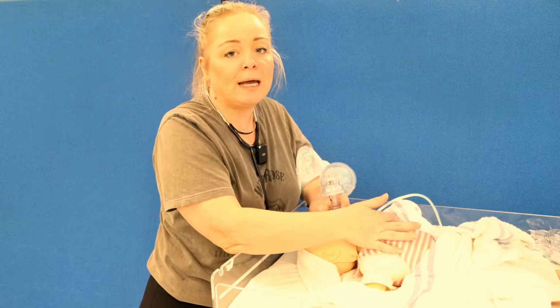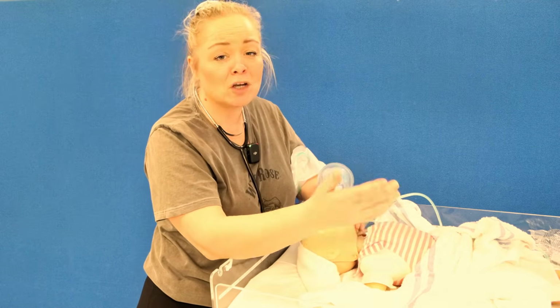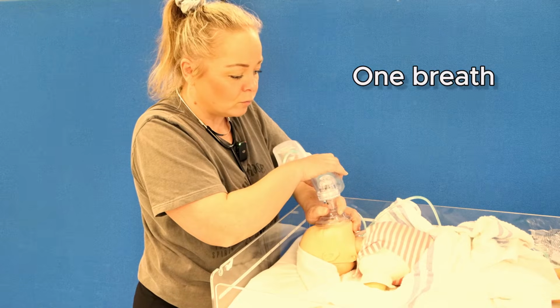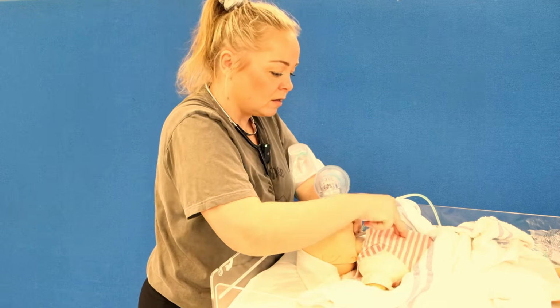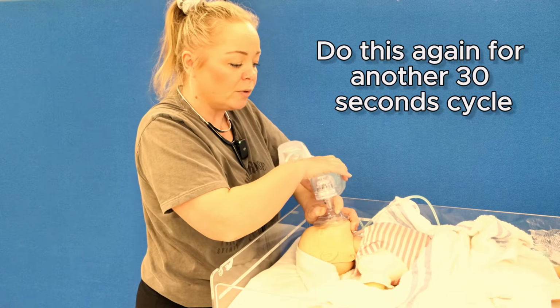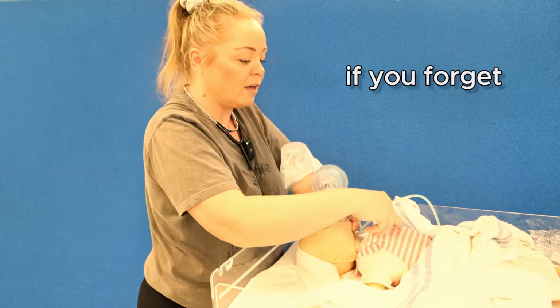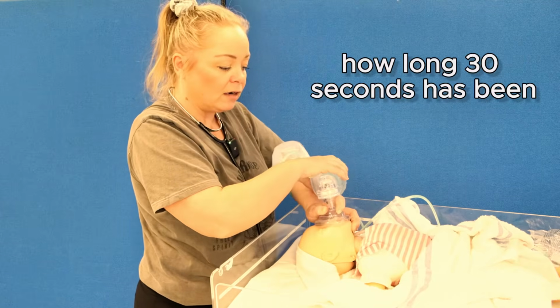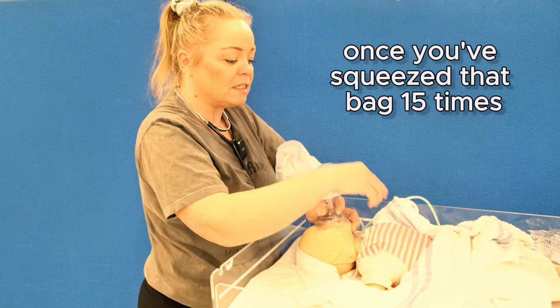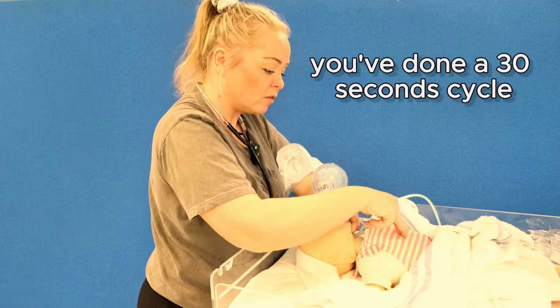The compressions we're going to landmark 1 finger breadth just under the nipple line. As baby has just been born, you don't have to worry about taking off baby grows. So 1 breath, 3 compressions, 2, 3. And we're going to do this again for another 30-second cycle. If you forget how long 30 seconds has been, because you've not looked at your timer, once you've squeezed that bag 15 times, you've done a 30-second cycle.